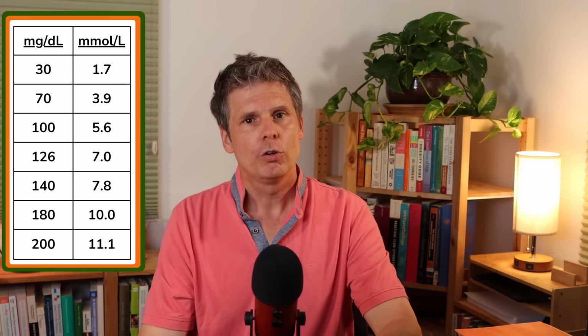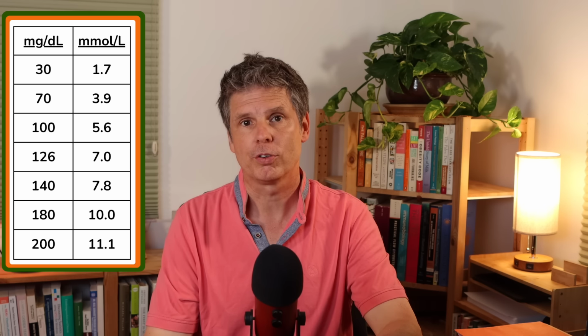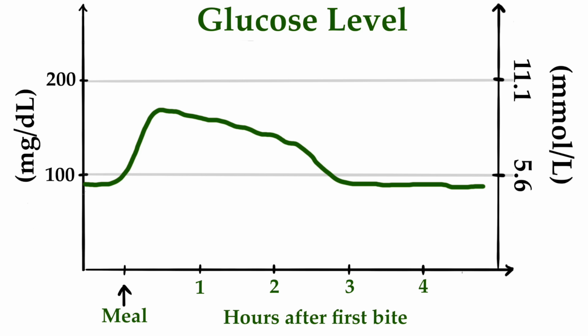If we are fully glucose tolerant, our glucose levels should be back to our baseline level under 100 milligrams per deciliter or close to it by the 2-hour mark, unless this was a particularly large or extended feast with several courses. So if your glucose levels after your typical meals look like this here, still quite a bit elevated, above 100 milligrams per deciliter 1.5 and even 2 hours after starting a meal, this may be indicative of glucose intolerance. And in a case like this, the cause is often insulin resistance.